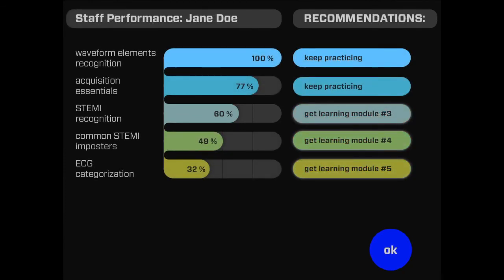The drill down continues to individual staff members. Each healthcare provider receives an individualized report detailing which targeted learning modules could be most useful for them.